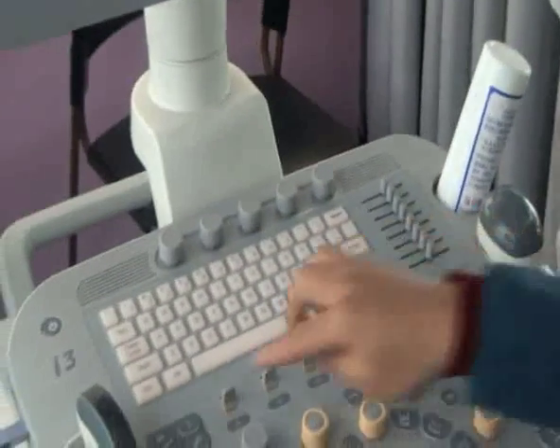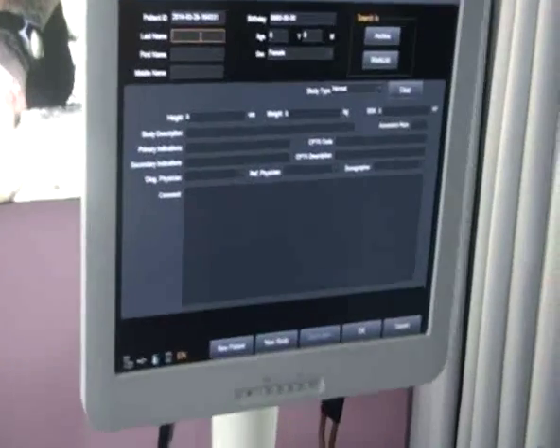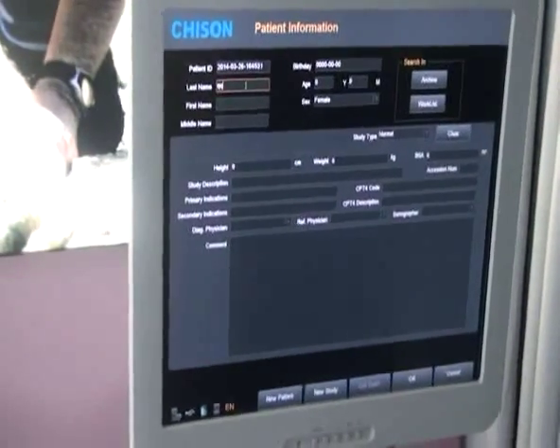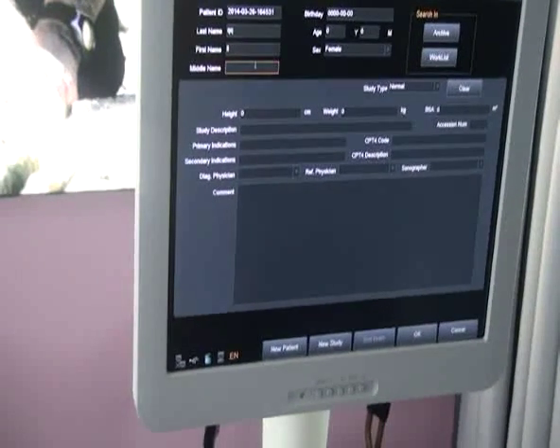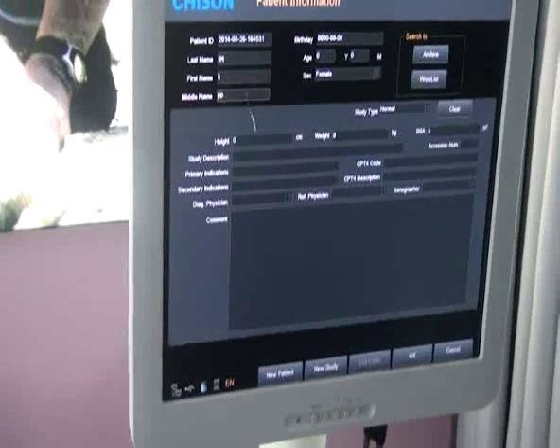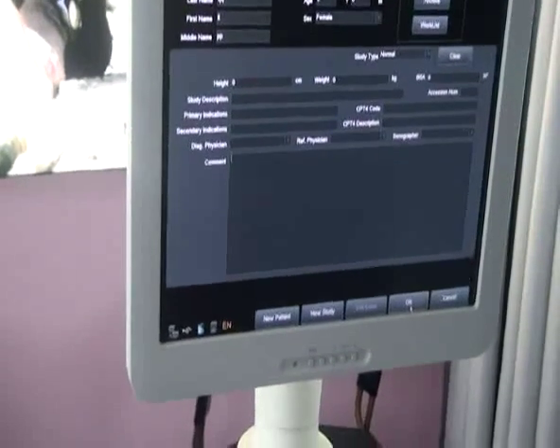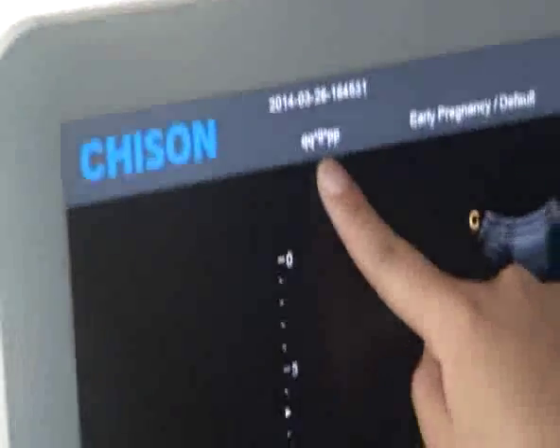First, press the patient key to create a new patient record. Input the information as we want: last name, first name, middle name. Move the trackball and press the Enter key to create a new patient. Here, you can see the patient information.